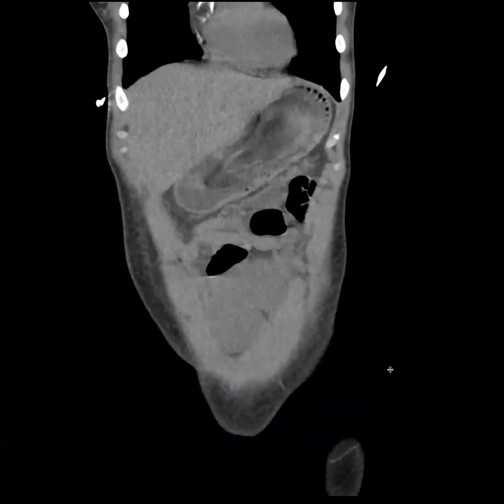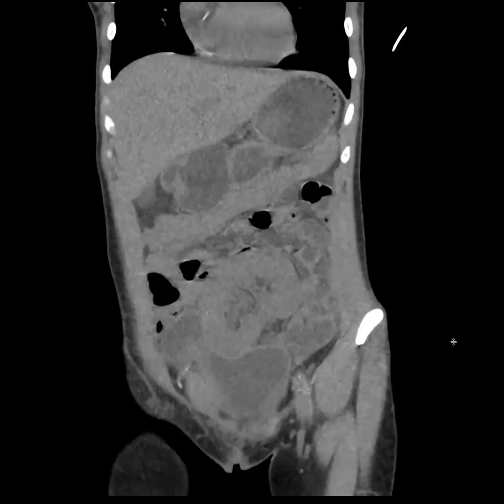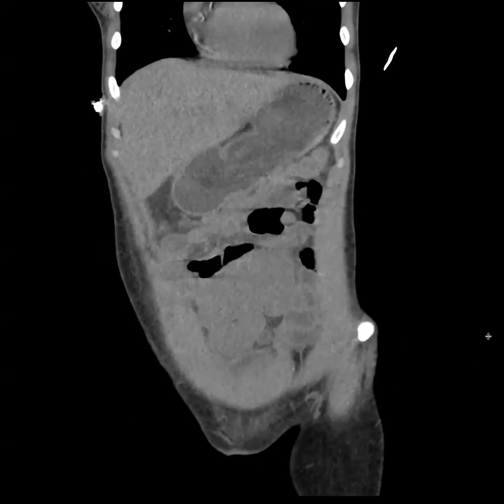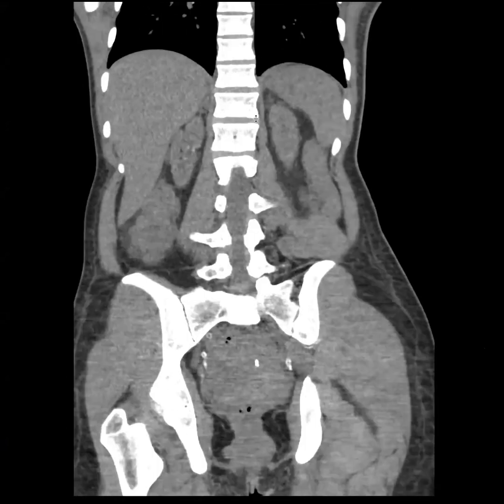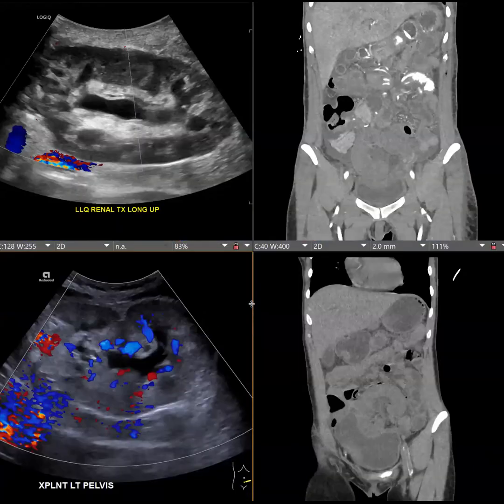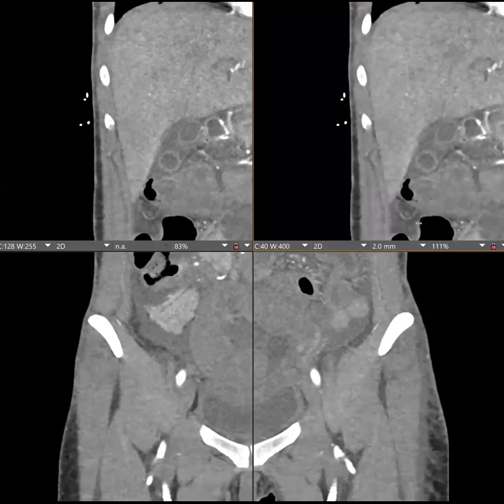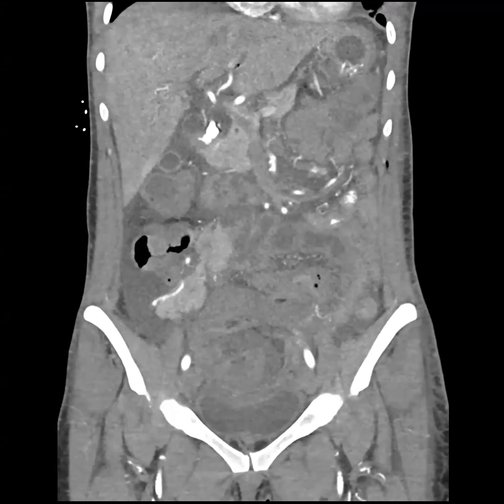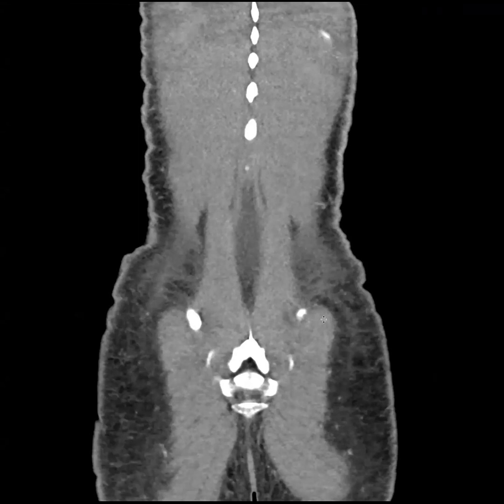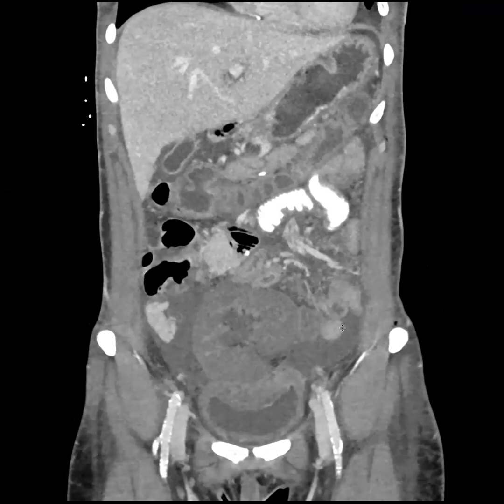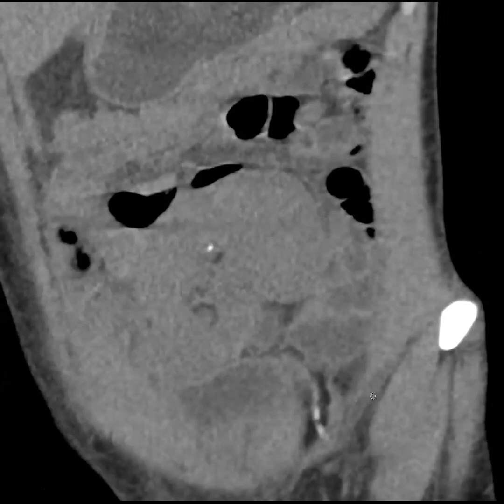This is a patient with a renal transplant. This is one of the baseline post-transplant non-contrast CT abdomen scans we obtained. The patient had a renal ultrasound showing Doppler flow into the renal parenchyma. Then the patient came into the ED with acute symptoms. This is what the new imaging looks like — let me also show you the venous phase — and then the prior for comparison.